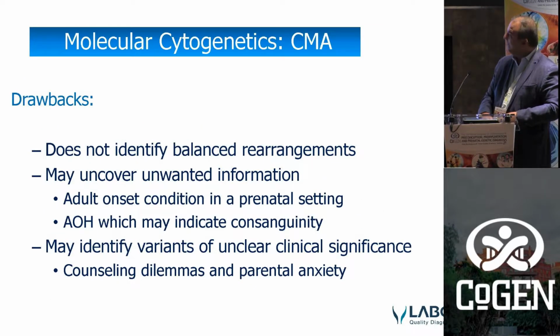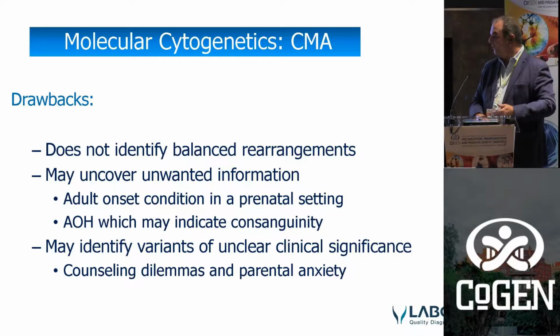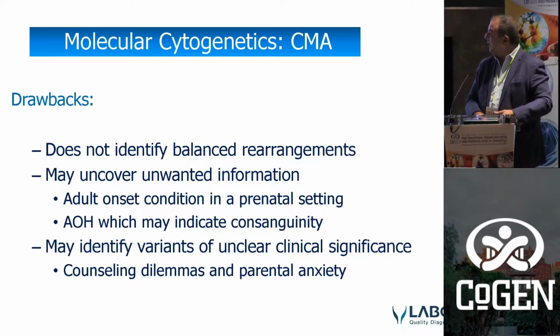What are the drawbacks? Well, this does not identify balanced rearrangements. In the prenatal field, probably this is not a drawback at all; it is an advantage. It may uncover unwanted information, such as adult onset conditions in a prenatal setting, or absence of heterozygosity, which may indicate consanguinity.